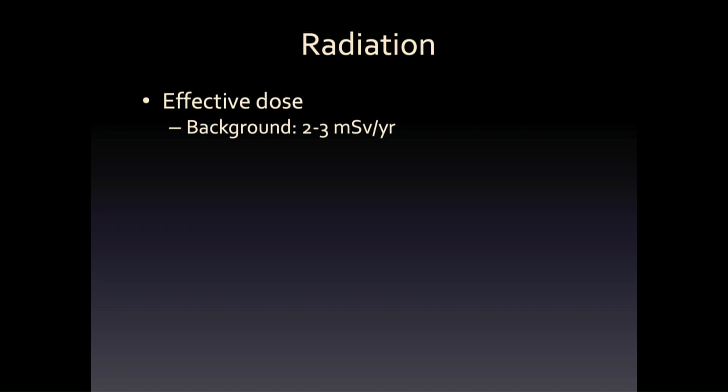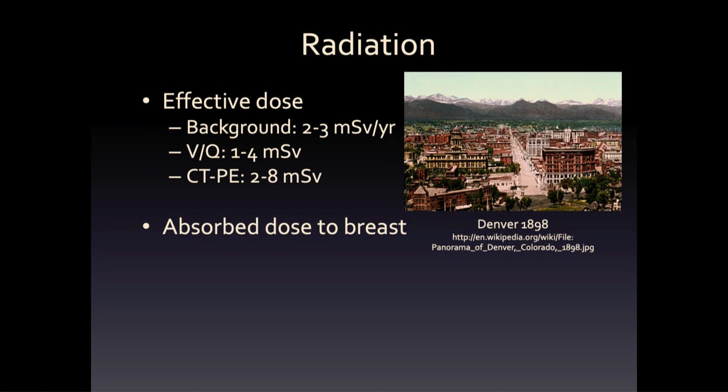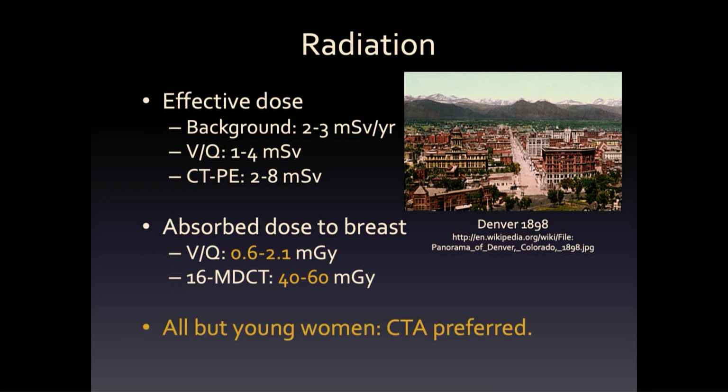Radiation is one topic. I'm from Denver, so I get more radiation than people do in most places, like here. And the big issue is actually that VQ is okay. It's that there's more with CT, particularly the breast dose. So for young women, maybe we shouldn't be doing CT.